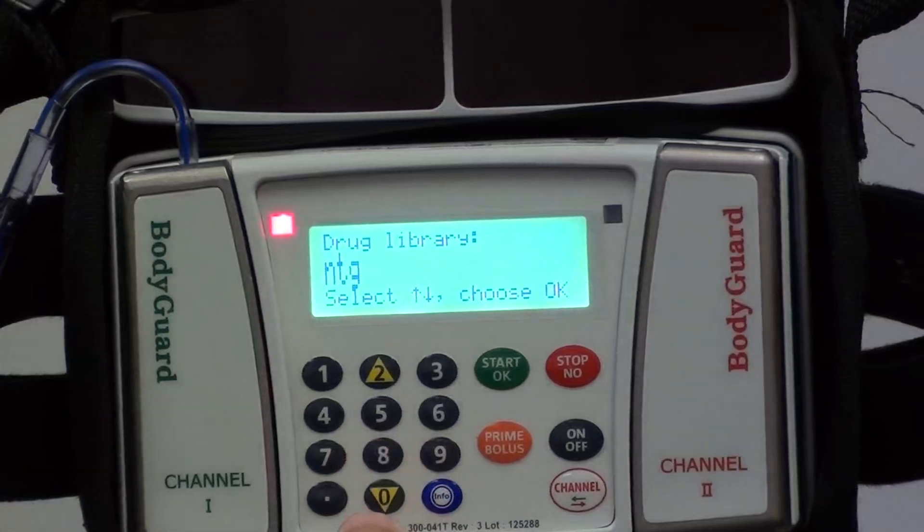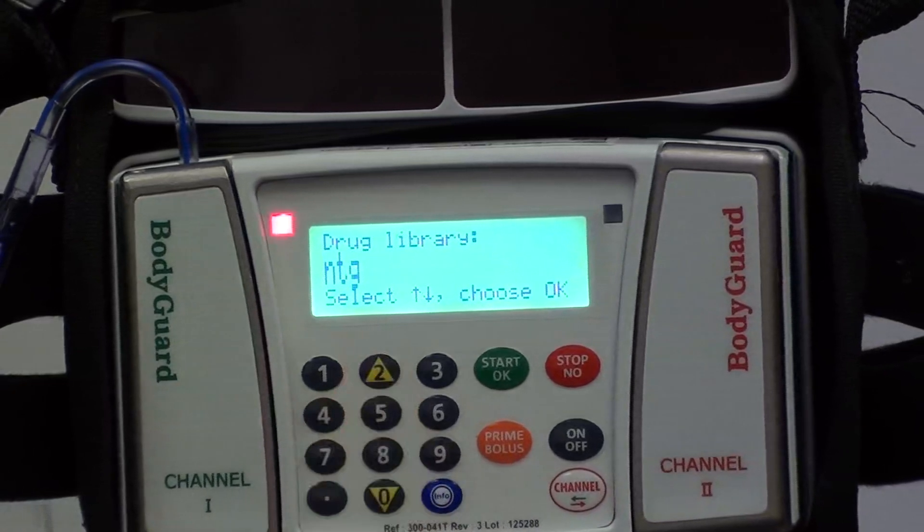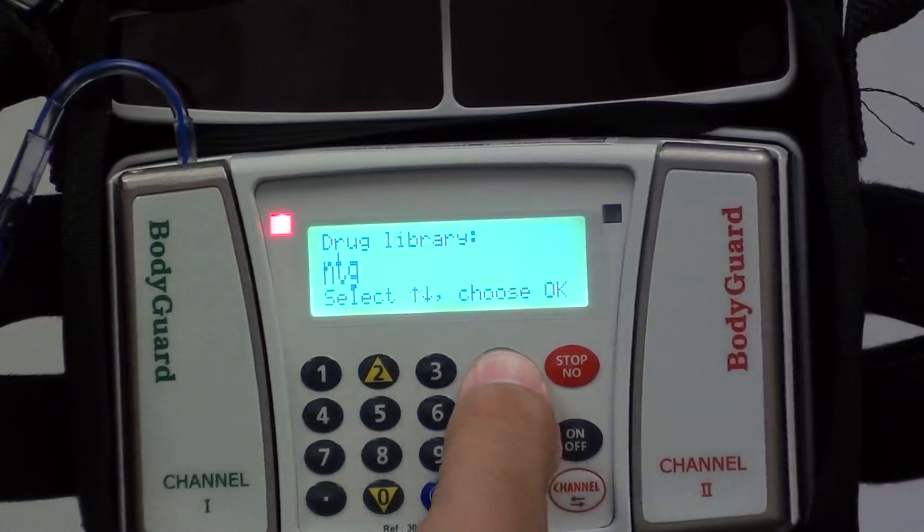You can choose the medications by using the two and the zero button as your arrows to flip between the medications. At this point we're just going to use nitroglycerin for this example. You'll choose your medication by pressing the start and OK button.